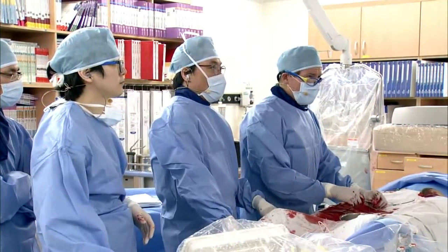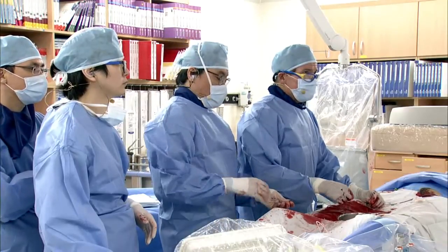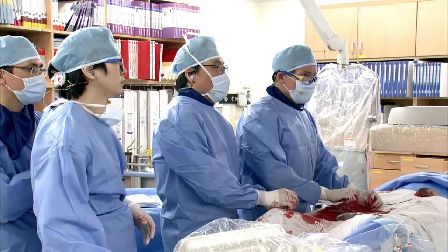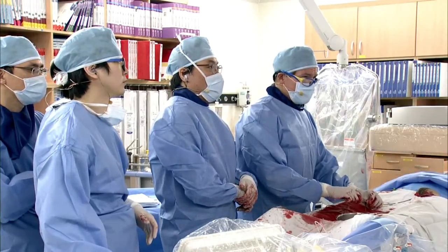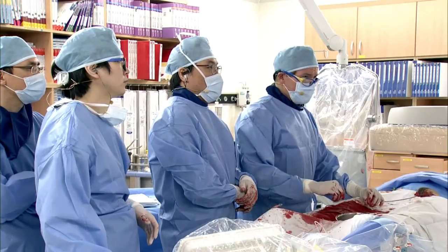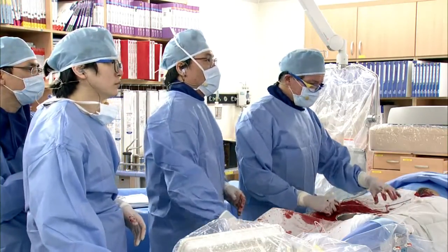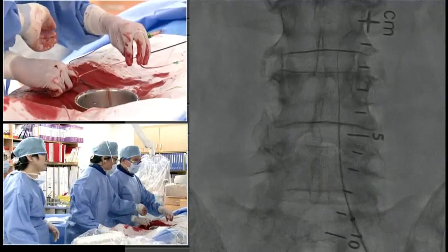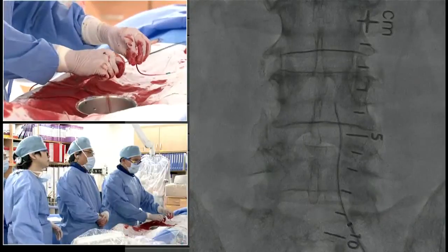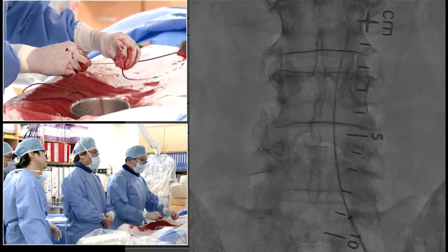We got pretty far, almost to the distal end of the occlusion with the various wires. The Boston, the V wire, we went in with the stiff glide. We got pretty good position. Just couldn't cross it all the way, so we're just trying to get the Omni back up and doing the same thing because we were pretty close.